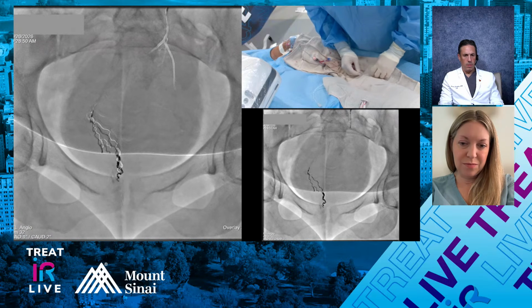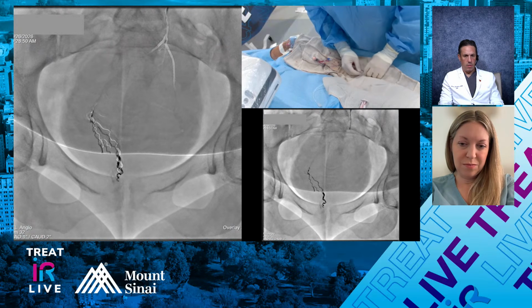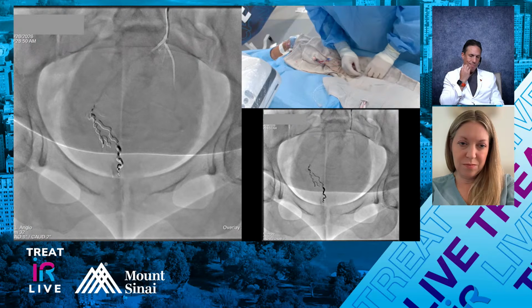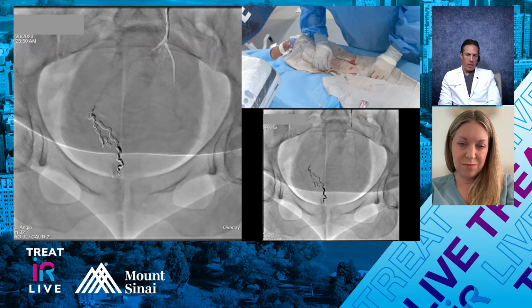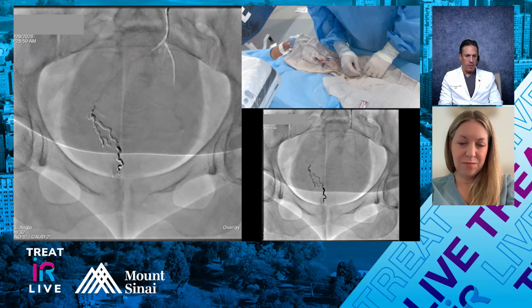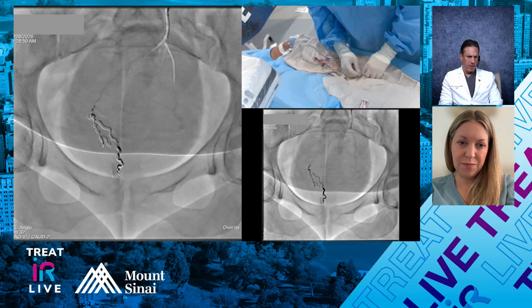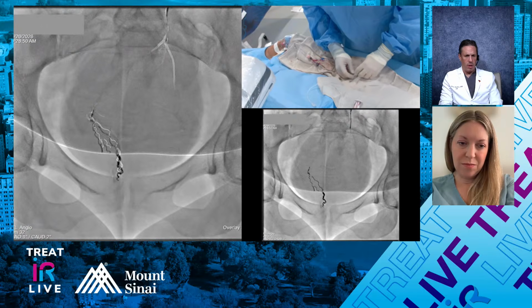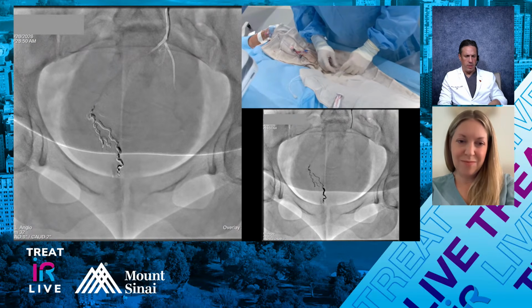Here, we're essentially right above this SRA bifurcation with our base catheter, so we have really good stability here. That's why I mentioned before I like the 110. I think Jesse mentioned that too, right? Because if you have the 110, you don't have to worry so much about pushing it distally if you have that option. In the young patient, it's not an issue at all. Sometimes it's important in an older patient with a little more tortuosity, and it becomes challenging.